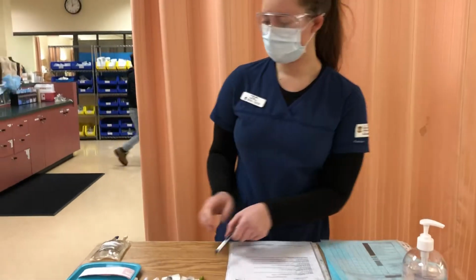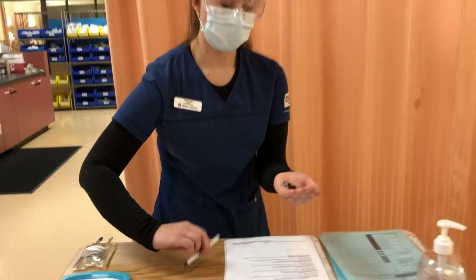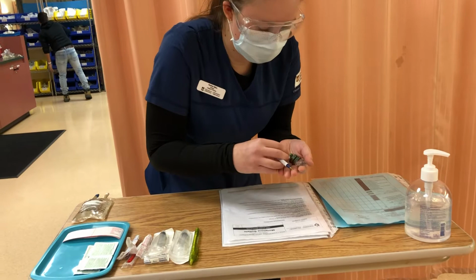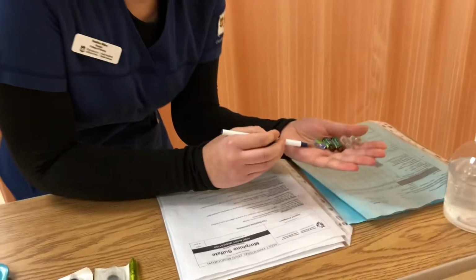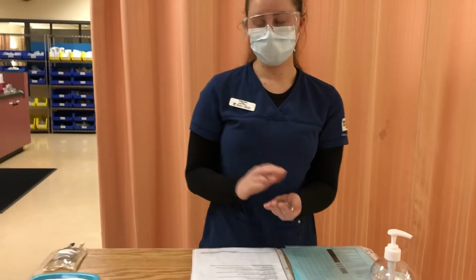So now I'm going to find my medication. So I have 5 ampules here, and for demo purposes, I'm just going to be doing my checks with one, but first I'm going to verify that all of these are exactly the same. So I have morphine. This is 10 milligrams per milliliter, for all of them, and these are all 1 milliliter ampules. These can all be given IV, and these are not expired.